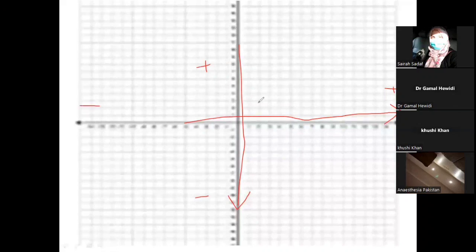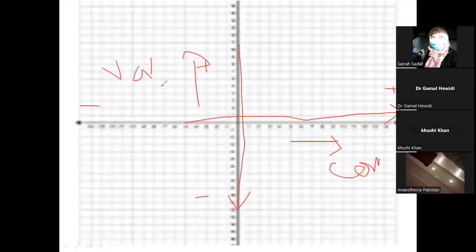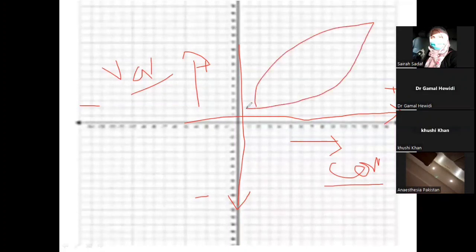Now, what do we need here? We need two different values. One value to be placed here and one to be placed here. When we call it a curve or scalar, one of them is constant and the other one is variable. All right? One value is constant and the other value is variable. And we call it a loop when both are variable, when both are changing. Got it? I will repeat it again. Don't worry.